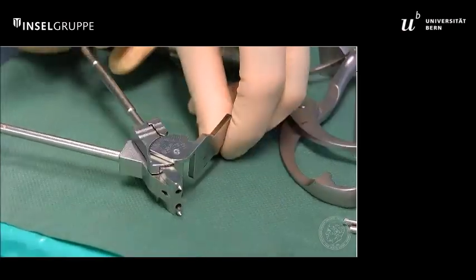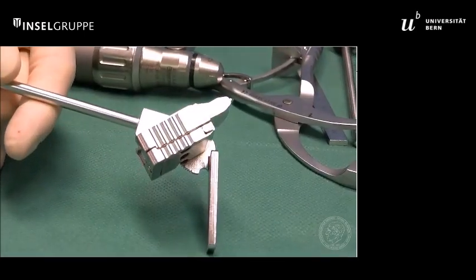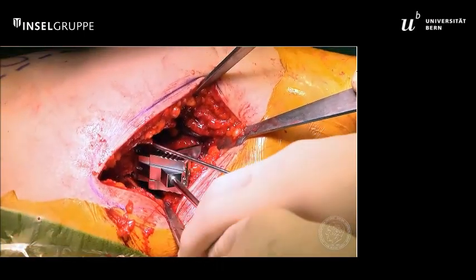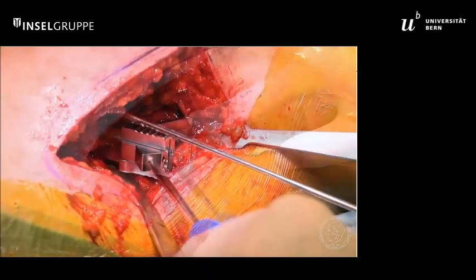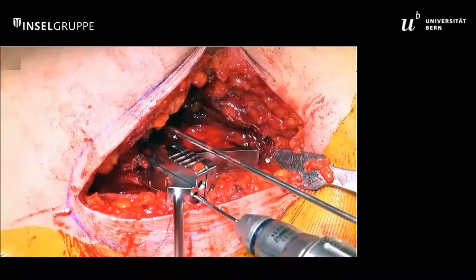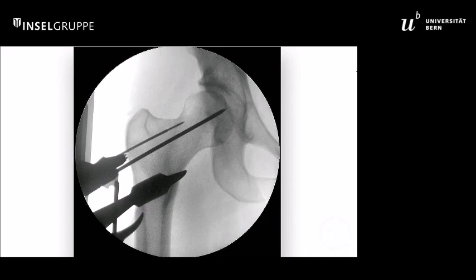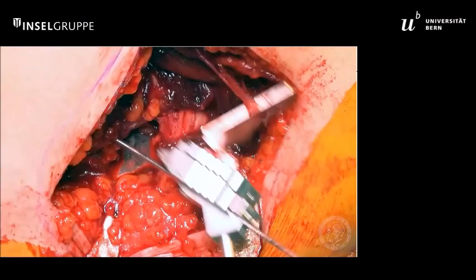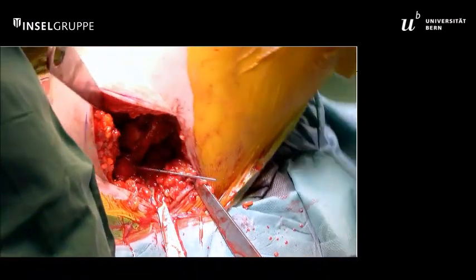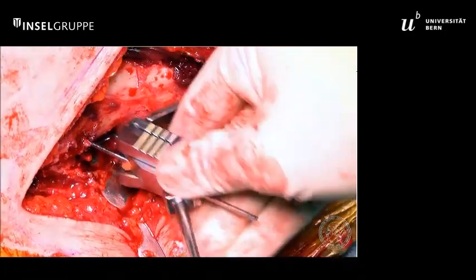The aiming block and positioner are adjusted according to the planned osteotomy. In our patient with an isolated rotational osteotomy and a 120-degree plate, it's exactly 120 degrees. The aiming block and positioner are placed along the lateral femur. The wing of the positioner should be parallel to the femoral shaft, and a 2.0-millimeter positioning wire is drilled into the femoral neck parallel to the guiding wire and checked radiographically. The aiming device is readjusted, and the first 2.8-millimeter K-wire is inserted after fluoroscopic control.